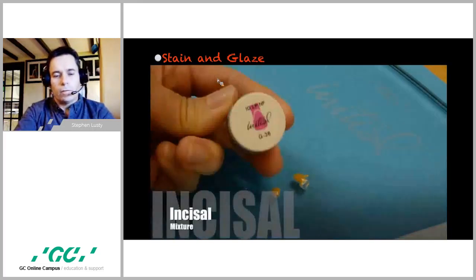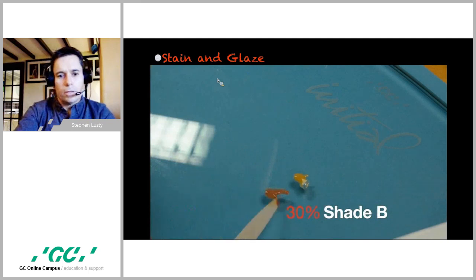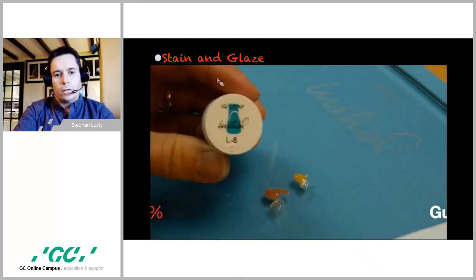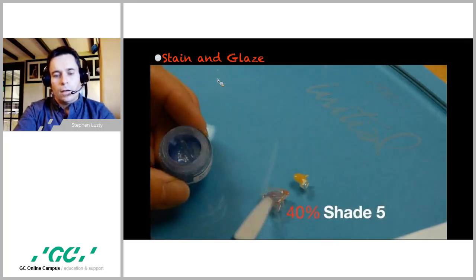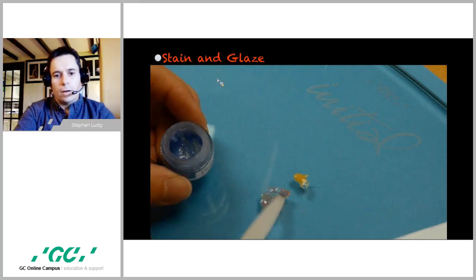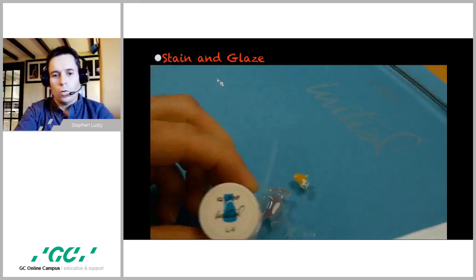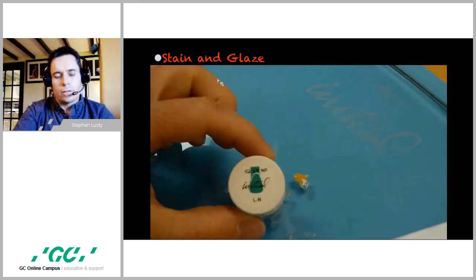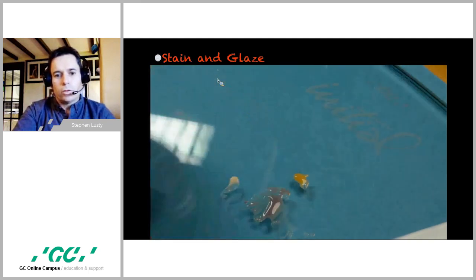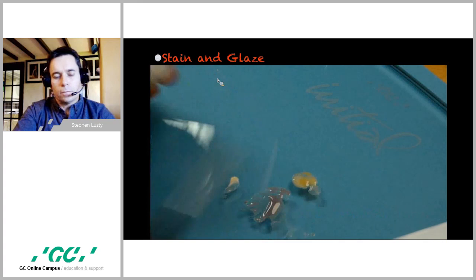So I dispense obviously whatever color I am going to use. I then make this incisal mix, which I always use the V shape for. I use the gum 36 and the L5, which I mix together. And this makes a really good sort of gray translucent shade. You can vary this by adding more blue if you've got a more bluish tinge, or more red if you've got a more reddish tinge down at the neck. And then the only color I don't mix with neutral is the luster value, because that I actually want to show the highlights on cusp tips, so I don't want it to look too much like you can see into it.